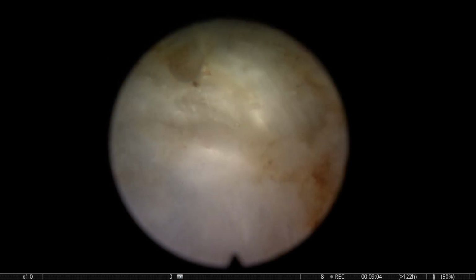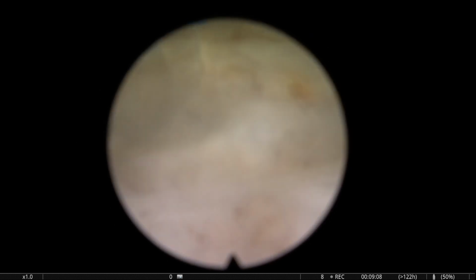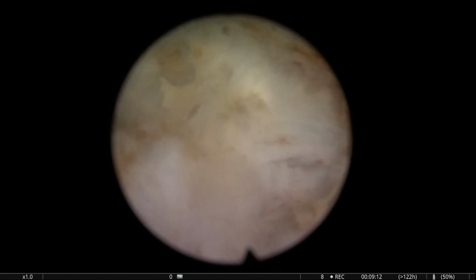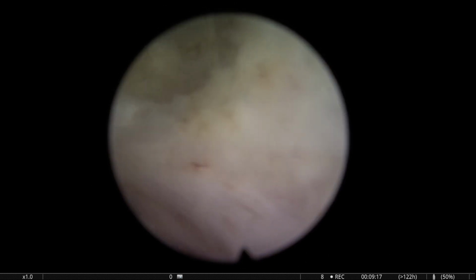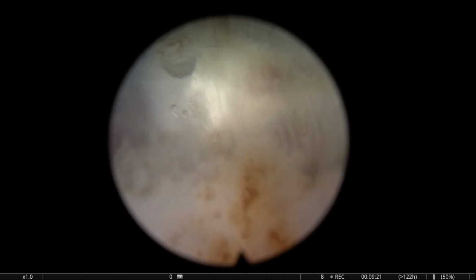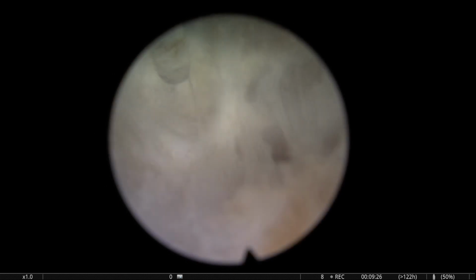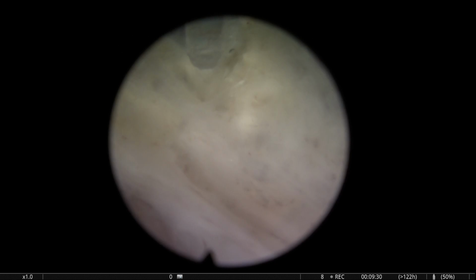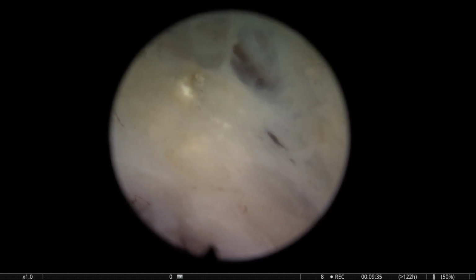I think in this moment, or probably near, there's going to be a little bit of fat visible. And when we see fat, of course, we need to correct the plane. Here I was trying to, also you see I'm going deeper anteriorly than the ascending line from the left side of the patient was showing. You see, so here again, we are correcting. You see, the plane that I was following was much under what I'm following now.